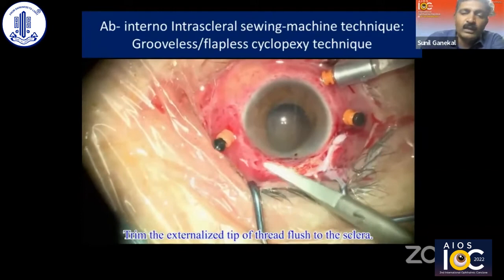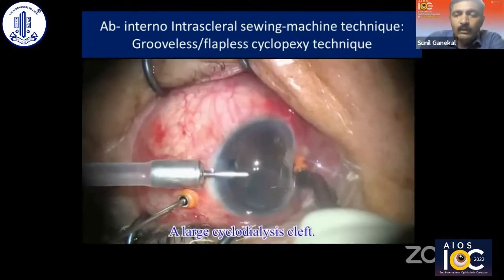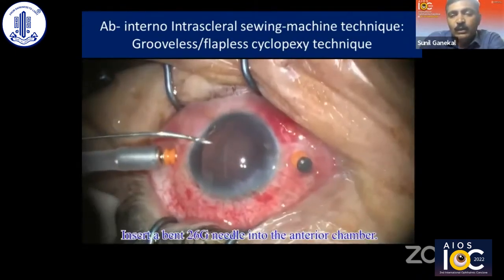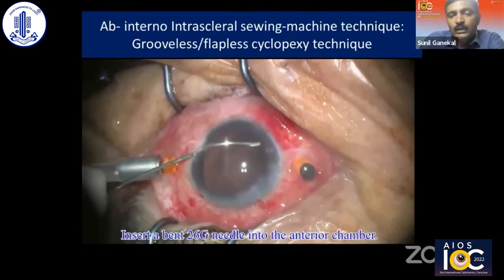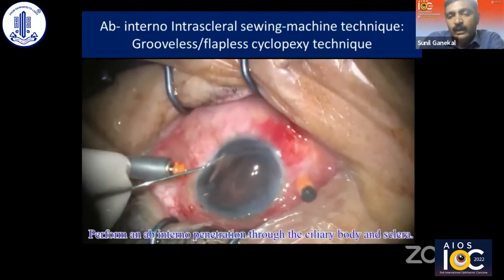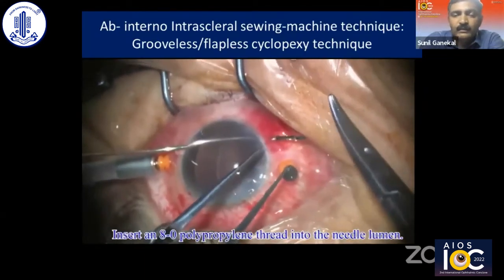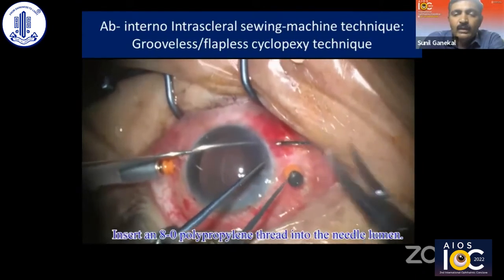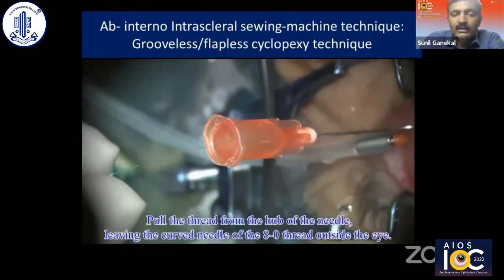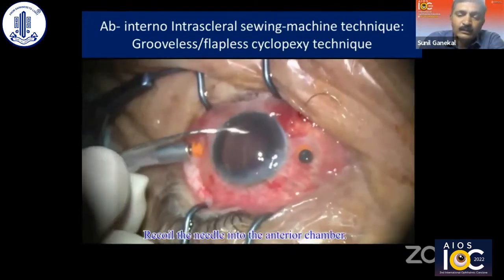This maneuver can be done transconjunctivally also, without doing a peritomy. Here in this case, the same maneuver is done, but without opening the conjunctiva. Go with a 26 gauge needle, come out through the ciliary body region 2 mm from the limbus, and using the same 8-0 Prolene needle, the same maneuver can be repeated. So one need not open the conjunctiva in all cases. You can get a good cyclopexy and definitive closure. This especially helps in large cyclodialysis clefts.